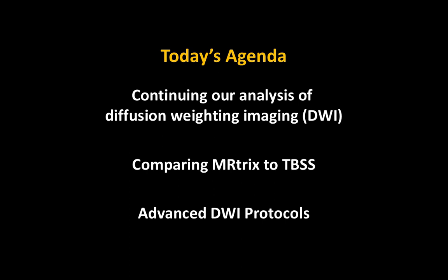And lastly, I'll be talking about some advanced DWI protocols. If you haven't used them already, I'll be talking specifically about multi-shell acquisition and why you may want to use that for acquiring diffusion images.